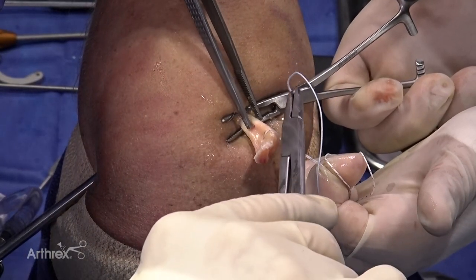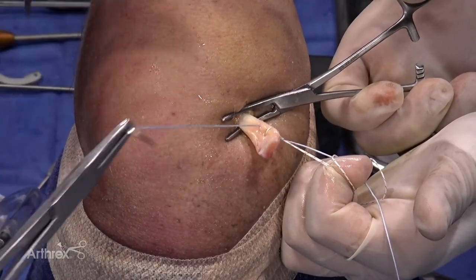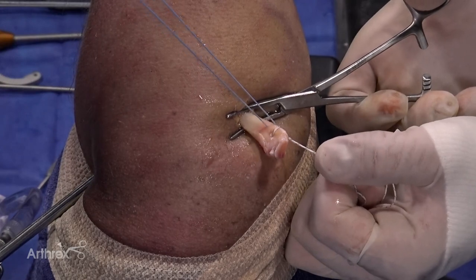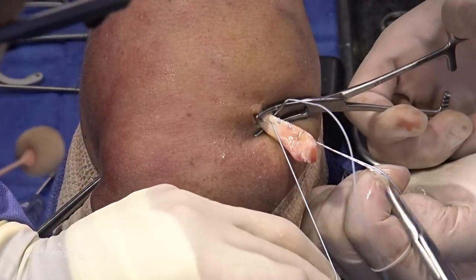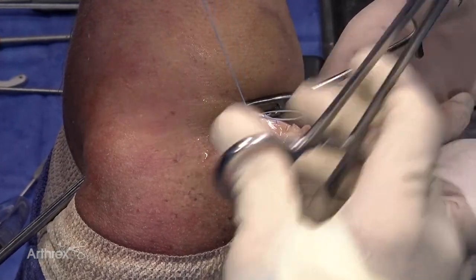Now we have our outside view. We're going to start just distal to where we've marked the tendon and work distal because we're going to do an onlay technique, which will preserve our length-tension relationship. We're going to whip stitch distally, making two to three passes and working about two to three centimeters distal.